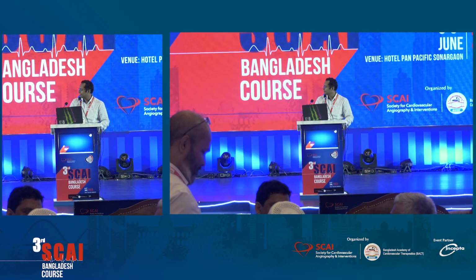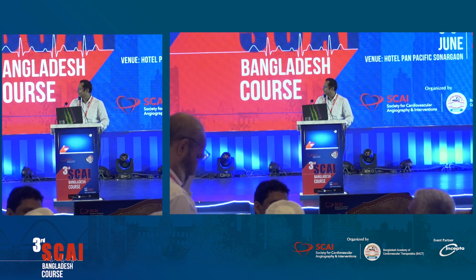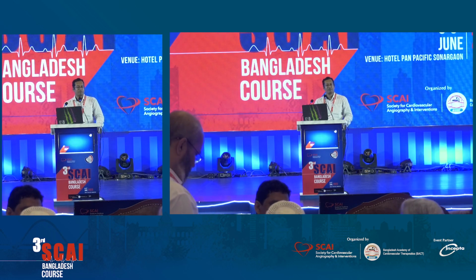Right femur, sir, 8, sir. 8 French. Can I make a comment here, please? Right, sir. Could I make a comment here, please?